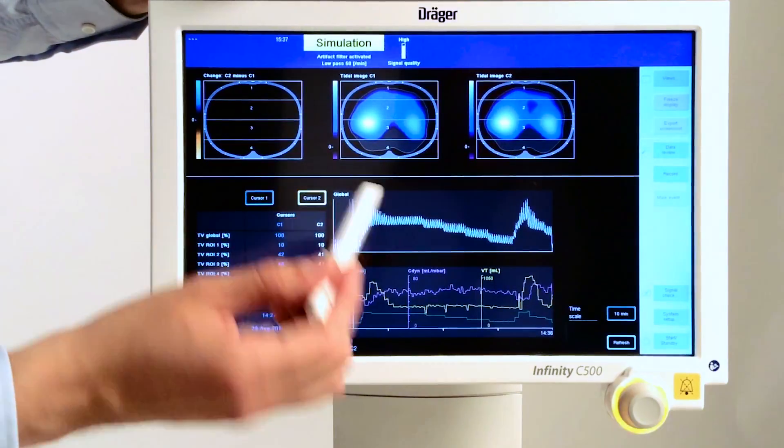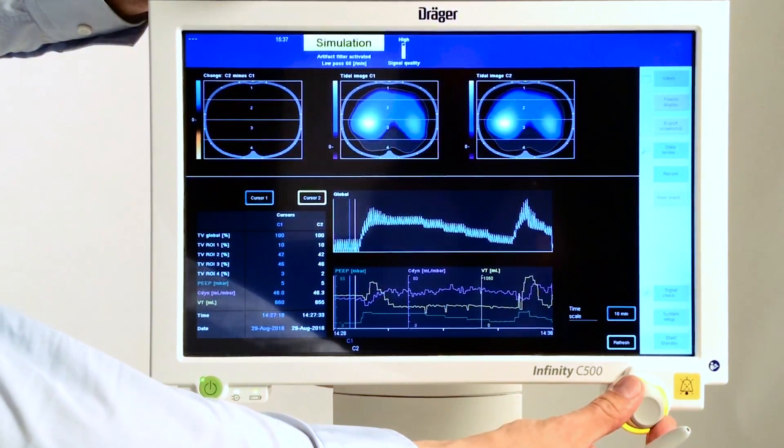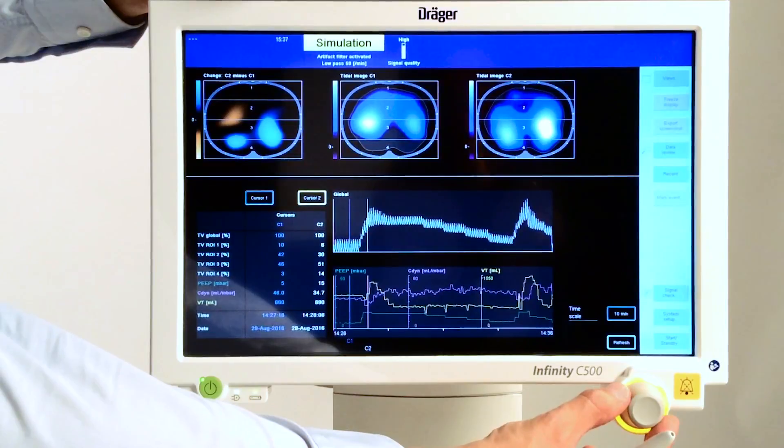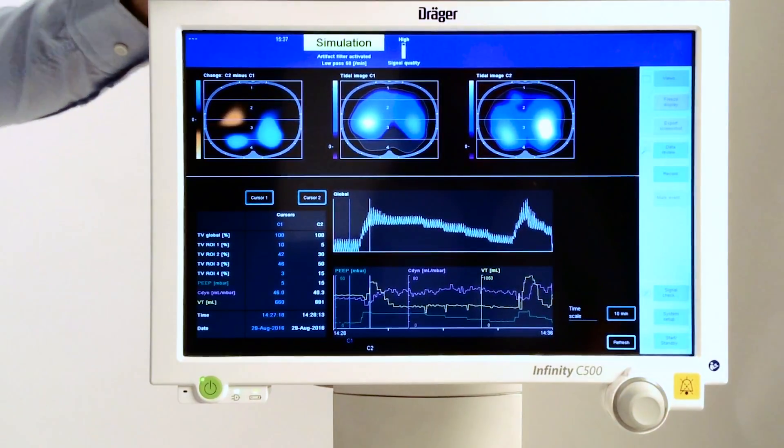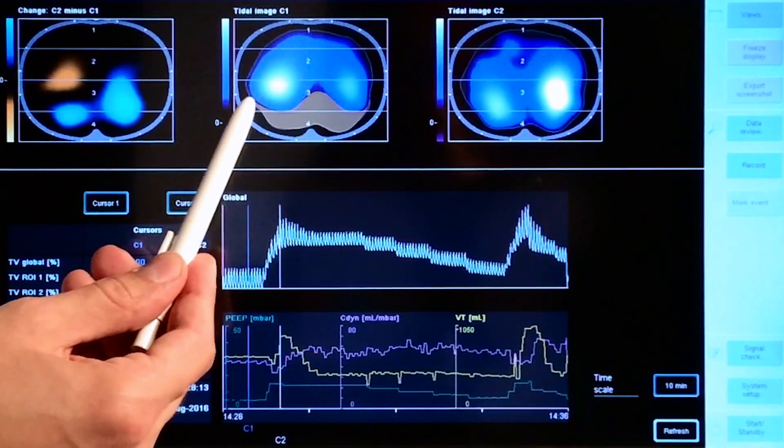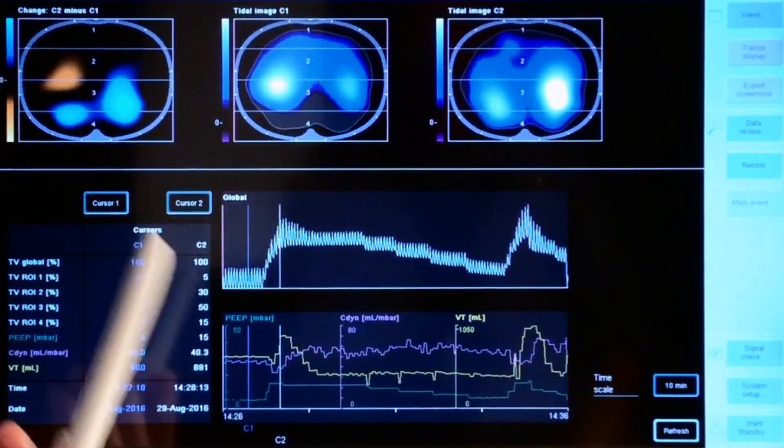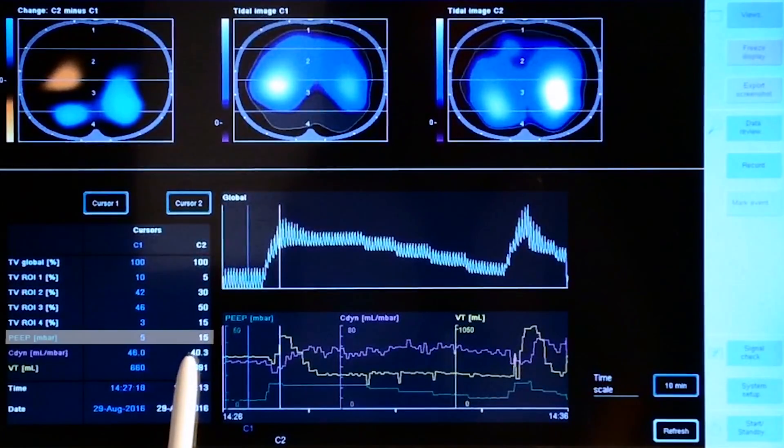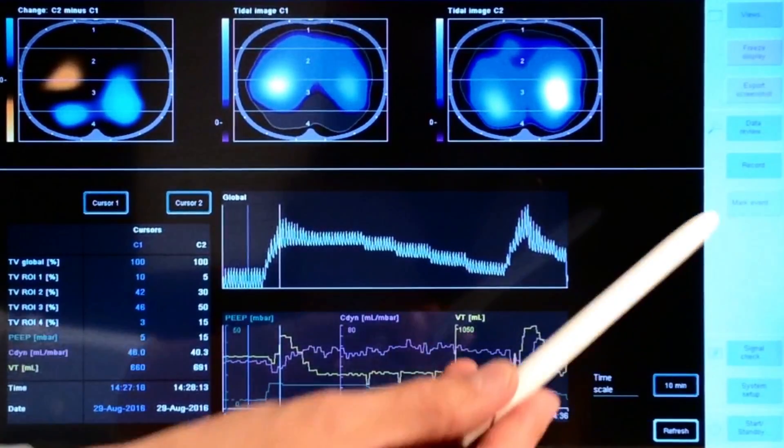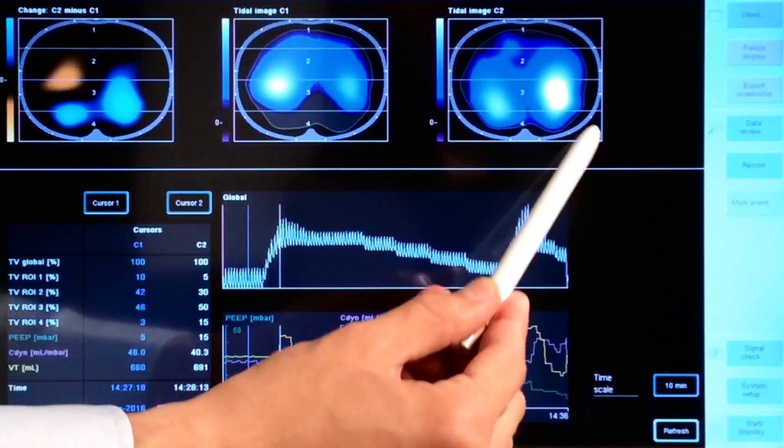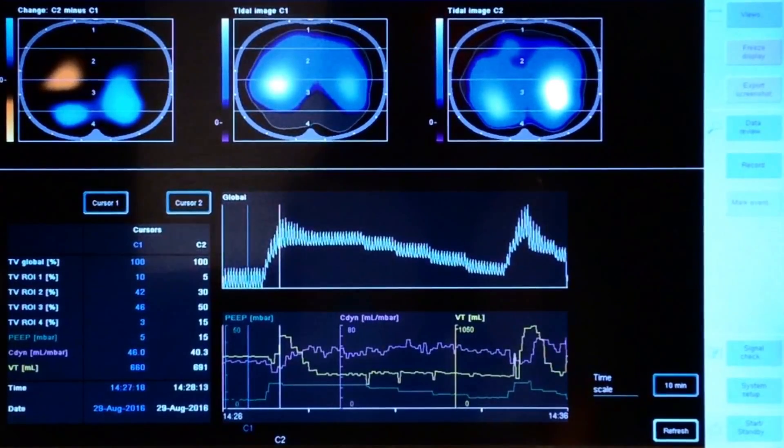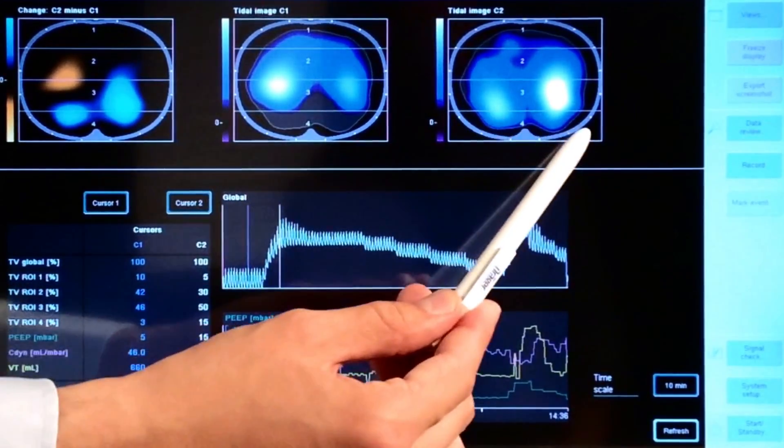Now we take cursor number two and move it breath by breath to see what's happening inside the thorax and how ventilation is redistributed. This is the baseline, and we can see the lack of dorsal ventilation. When we increase PEEP from 5 to 15, we see a significant increase in dorsal region number four. As you increase inspiratory pressure, you can see parts of the lung opening up.